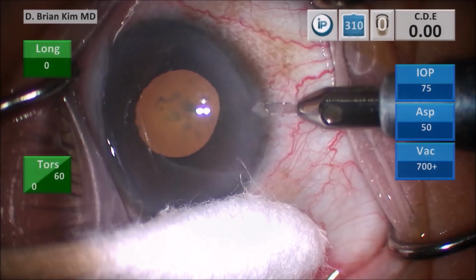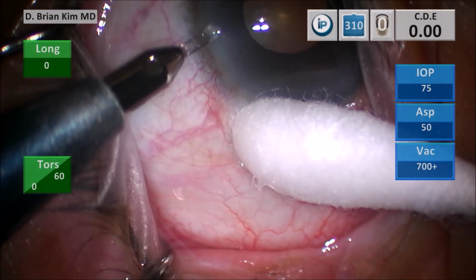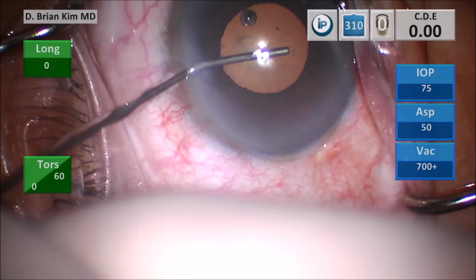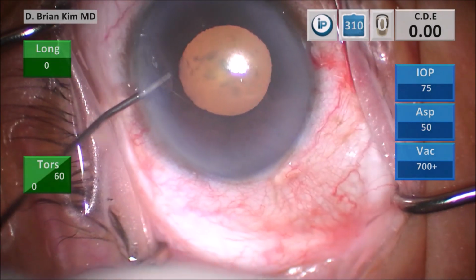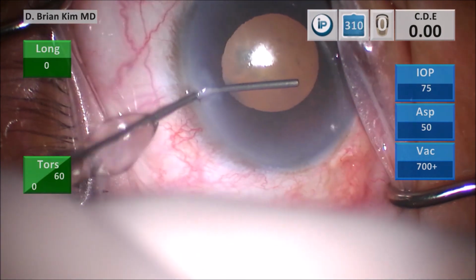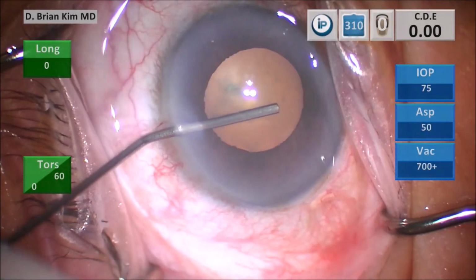I make my two paracenteses incisions. I inject intracameral lidocaine and epinephrine, and you can see I'm gently and slowly going on top of the iris and also under the iris, very gently, gentle pulses to help make sure that epinephrine gets all the way around. I inject my dispersive viscoelastic into the anterior chamber, and then I do my triplanar corneal incision.